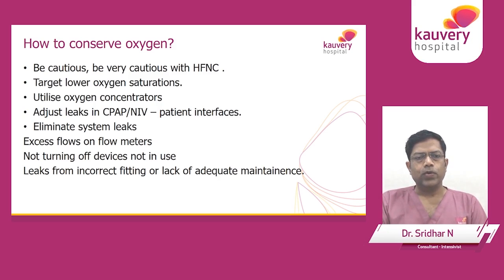The other thing to do is when our patients are on CPAP or NIV modes, please ensure that you're using the appropriate size mask to minimize the leak. A significant leak can significantly increase the amount of oxygen that is being wasted. So this is not even going to the patient. This oxygen is being wasted, it's just entering the environment. And the most important thing is to use the appropriate fitting mask to ensure that leaks are at minimum.